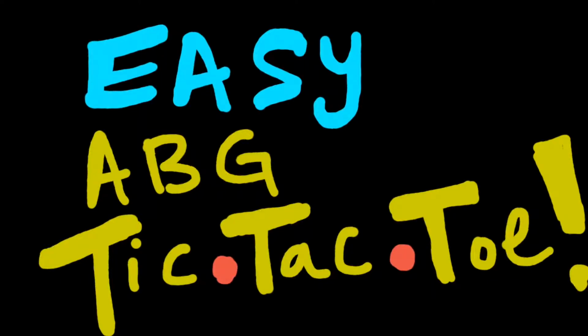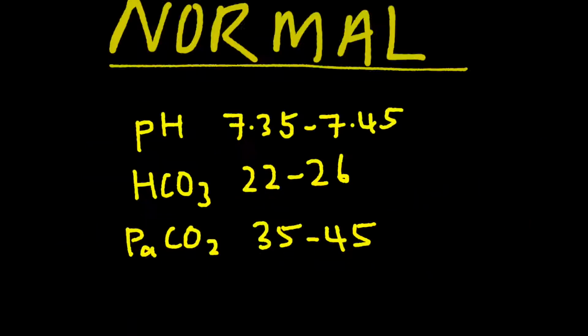The purpose of this video is a guide for you to interpret the arterial blood gas results in a simple version. For this, we need to know the regular and normal values for pH, HCO3 and PaCO2. For pH, the normal range is 7.35 to 7.45. HCO3 is 22 to 26. And PaCO2 is 35 to 45.